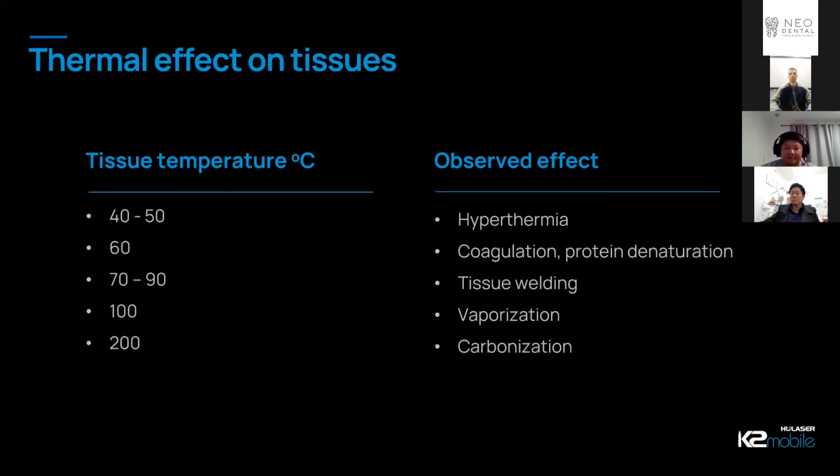laser therapy. As you increase the temperature upwards to 60 degrees, you start getting coagulation of the tissues, and that's what we want when we're wanting to get hemostasis or control the bleeding. And if we go even higher, that's when the tissues sort of melt over each other, sort of like suturing it together to promote better healing. And the power wattage is around 0.5 watts for this.